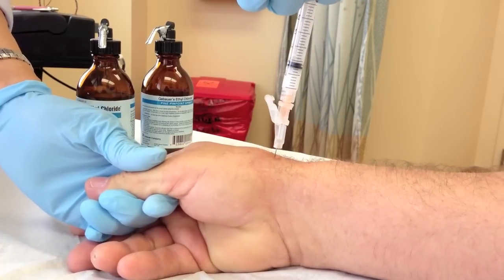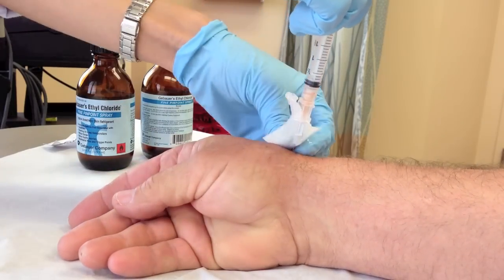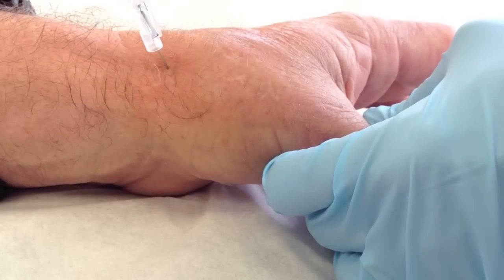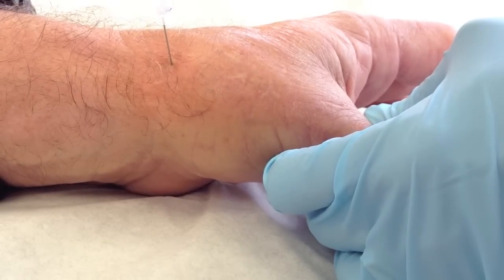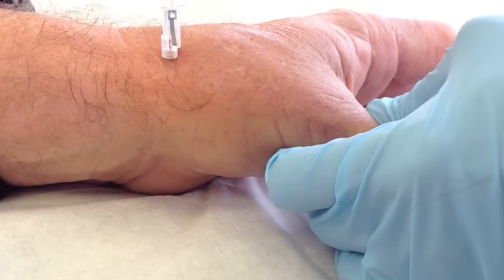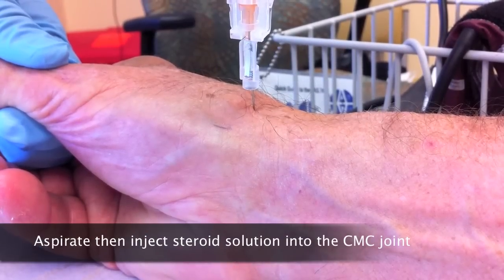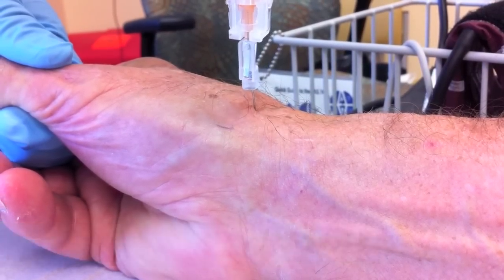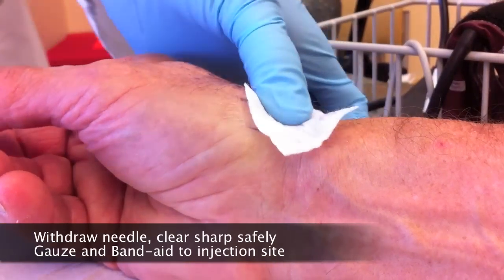Sometimes the needle goes straight into the joint, as with this Parkinsonian patient — note that the distal thumb traction also helps stabilize the patient's tremor. But more commonly, you might need to tap along the underlying bone before your needle sinks into the CMC joint. Once you are in the joint, aspirate and inject; within the joint you should feel minimal resistance to flow.